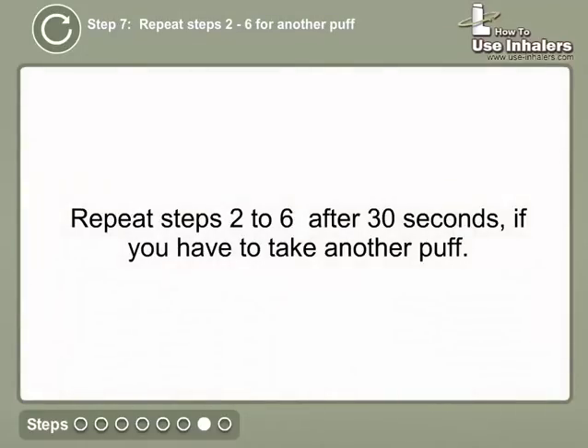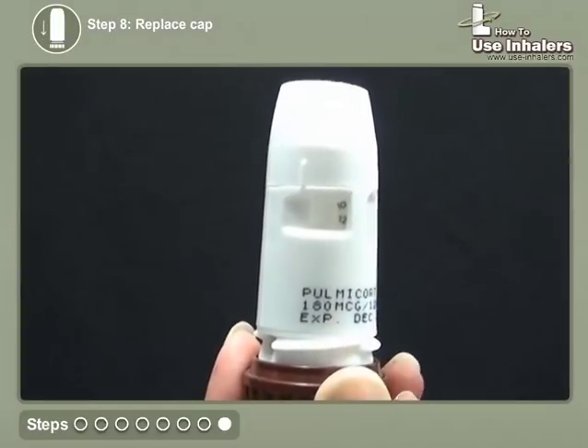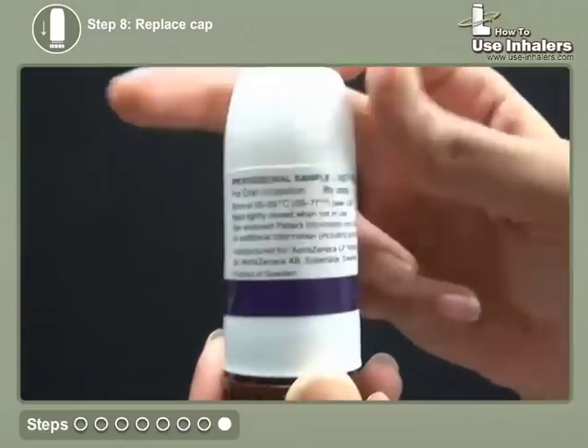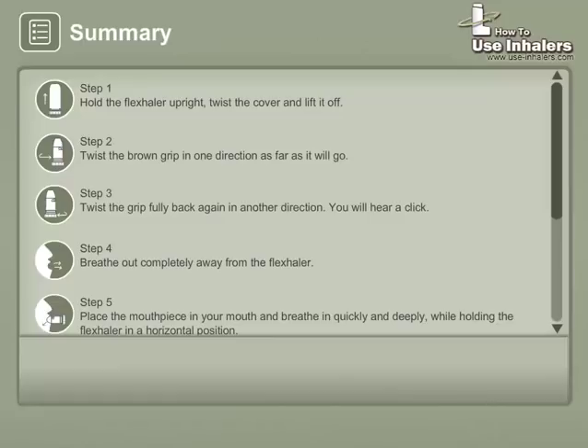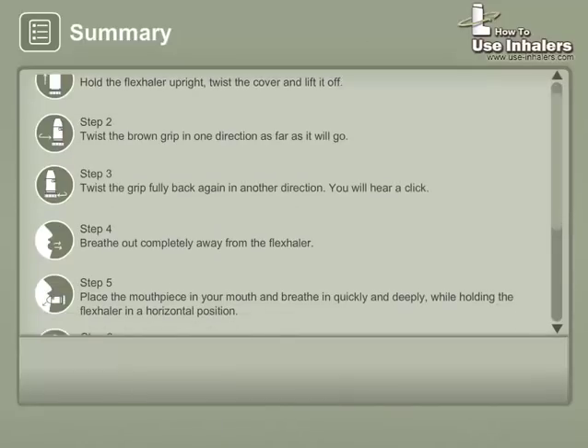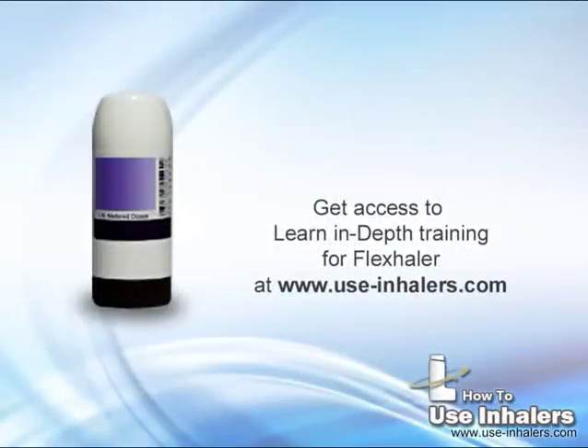Repeat steps 2 to 6 after 30 seconds, if you have to take another puff. Replace the cap.